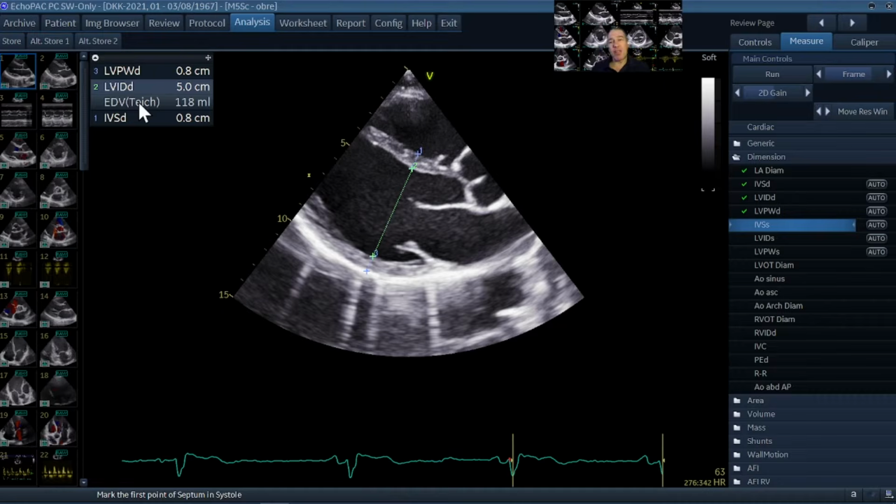It can be used if you are sure that there is no other pathology within the ventricle, that is, that the ventricle has no regional wall motion abnormalities. But it's a very rough estimation, and it has to be checked. It is just based on a formula which has been derived from a sample of patients, and this is not what we use today as a standard. For that we would use a two-dimensional measurement or maybe even 3D echo.